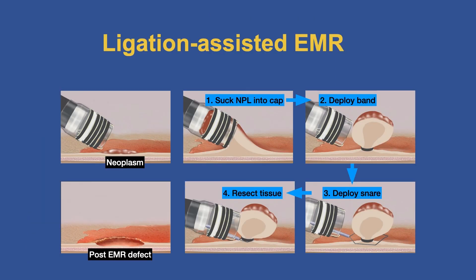Ligation-assisted EMR is, in my opinion, one of the most elegant procedures we perform — so simple and quick. We start by sucking the lesion into the cap; there are multiple bands so we can do this piecemeal if needed. Then we deploy the band, deploy the snare below the band, resect the lesion, and you see the post-EMR defect.